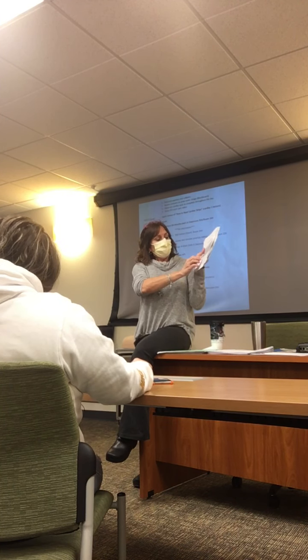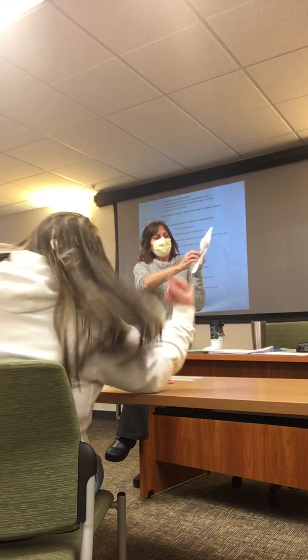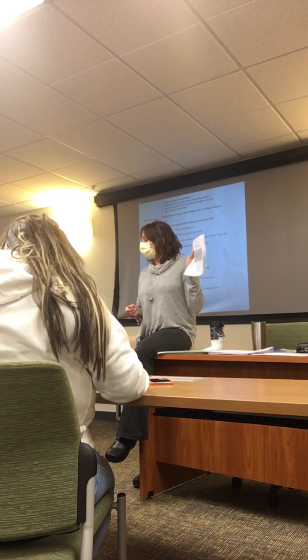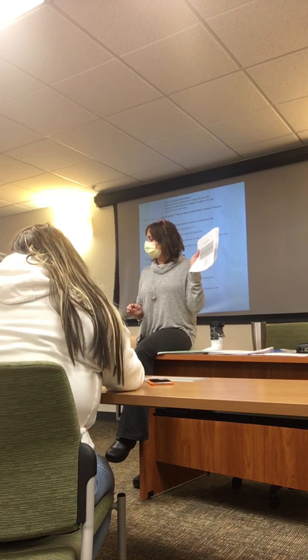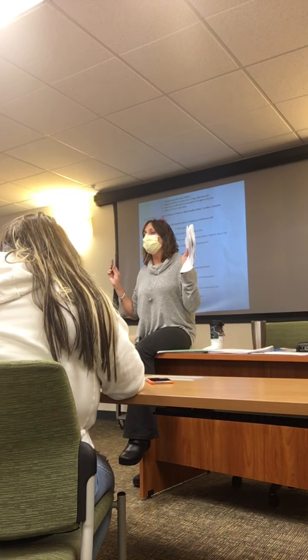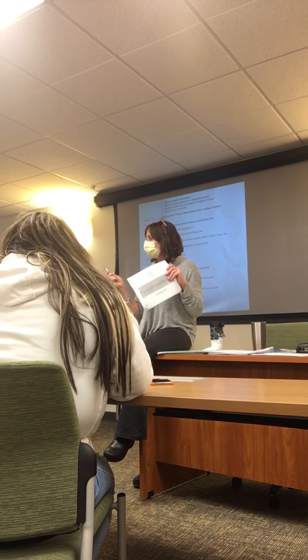My atrial rate, does that look regular? Are my P waves pretty? Walk it out, okay. So the rate, how do I get the rate? Count the R waves in a 6-second strip, and you get how many? 5. So 5 times 10 is 50. Don't you wish all the math on the exams was this easy?